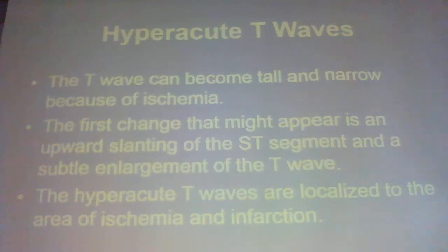Okay? When I say a big, huge T wave, as a general rule, if it's more than half the height of your QRS, then it's probably hyperacute. Okay? So what does that tell you? I got chest pain, shortness of breath, nausea, and vomiting, do a 12 lead, no ST elevation, but I got big T's in 2, 3, and aVF. What? New onset. New onset, absolutely.